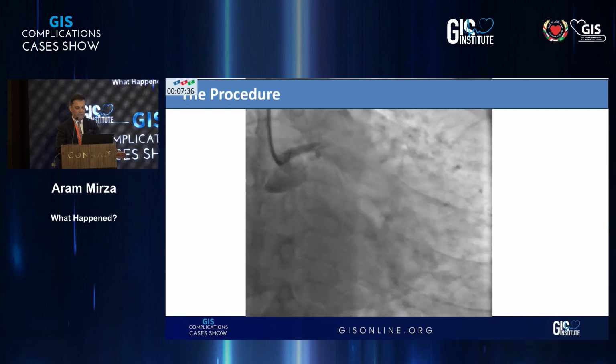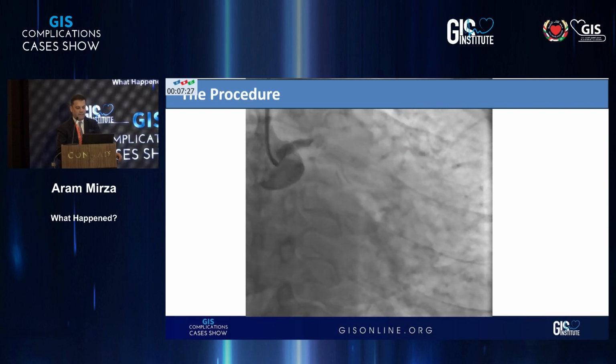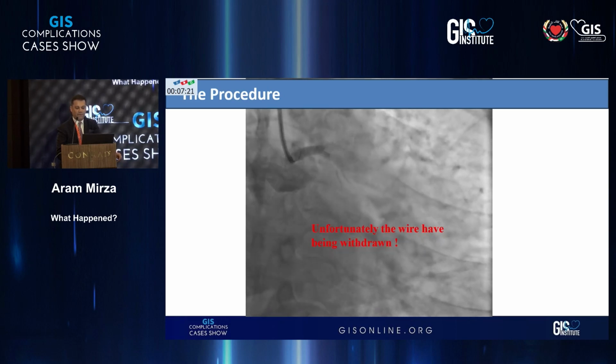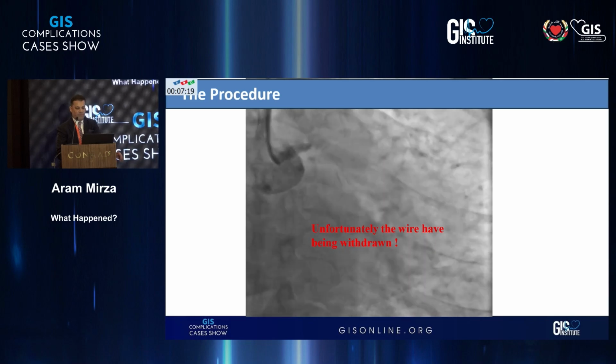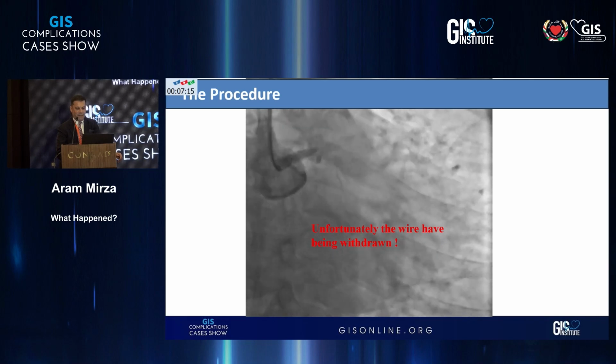So what we see in this angio: there is TIMI zero flow in the left system, and we have a white area at the beginning, in the ostium of the left main stem, extending to the ostium of the LCX and the LAD. Unfortunately, the wire has been withdrawn from the left system. So we have this: the patient has almost crashed, and there is no wire inside.